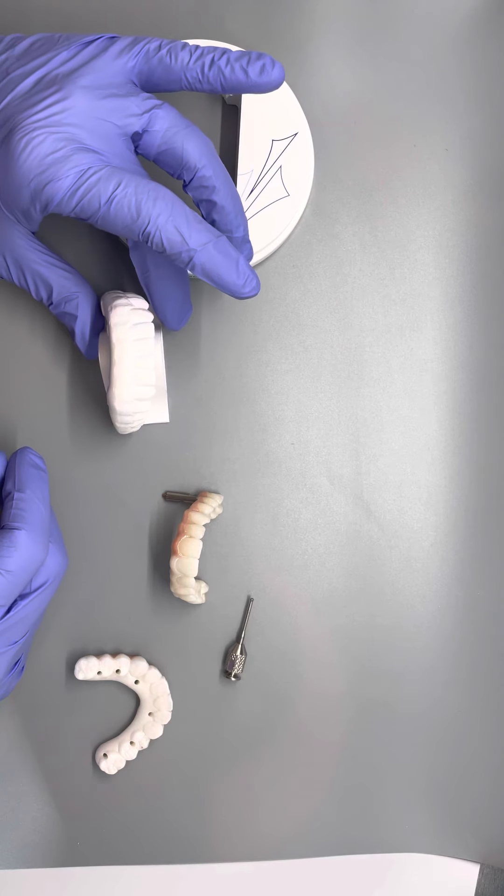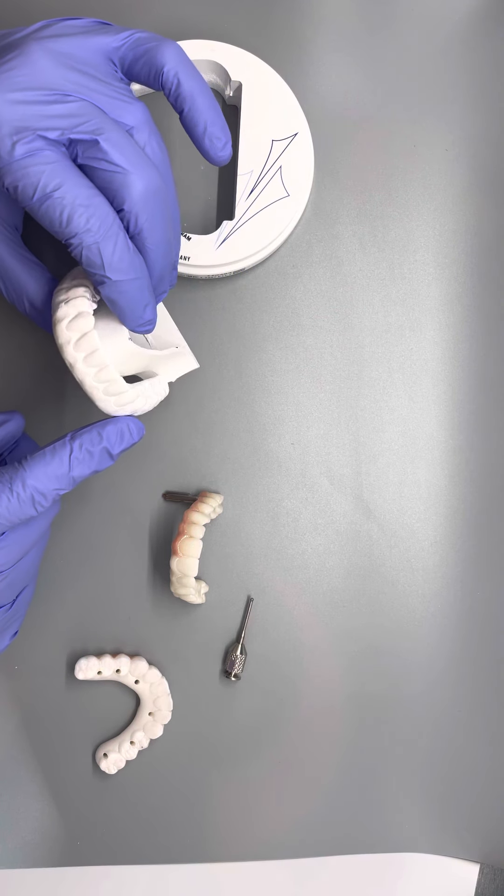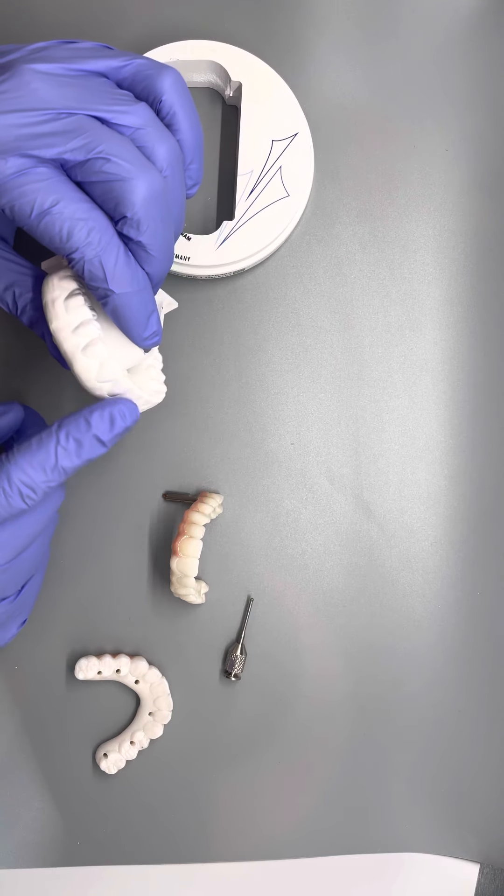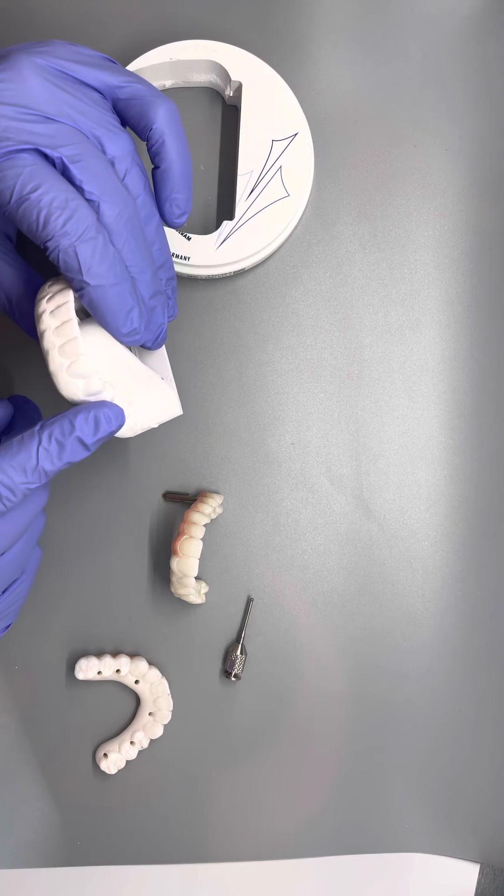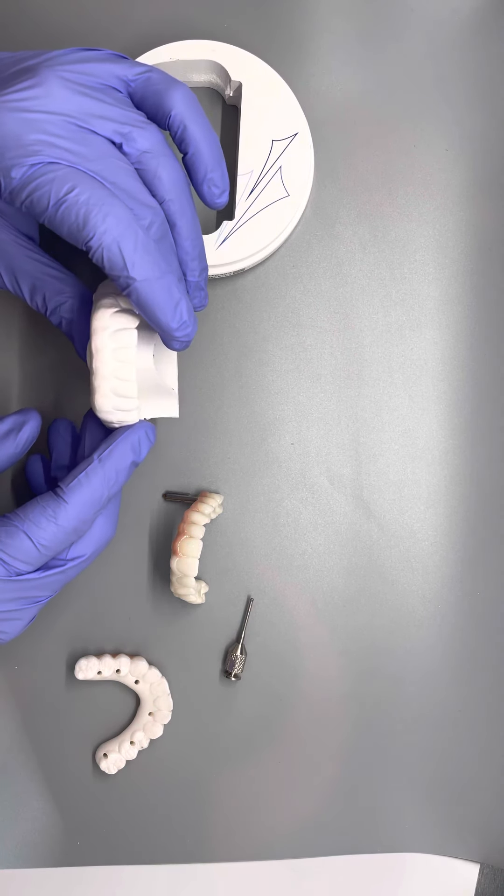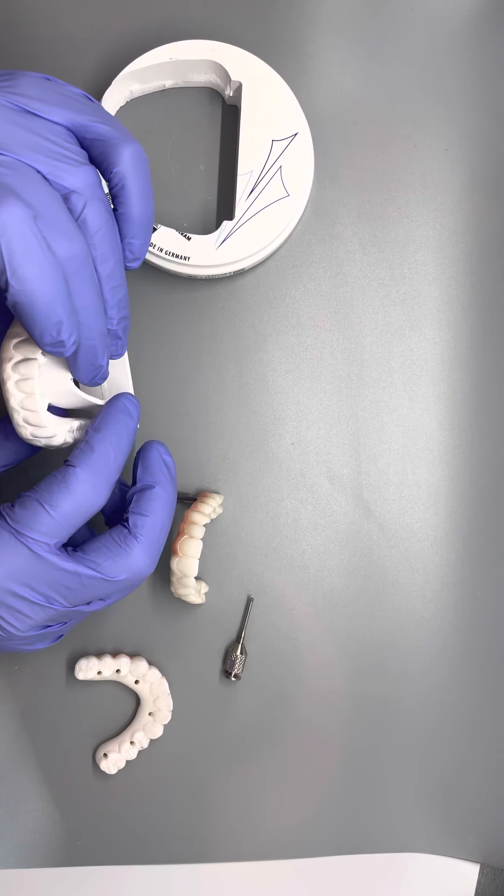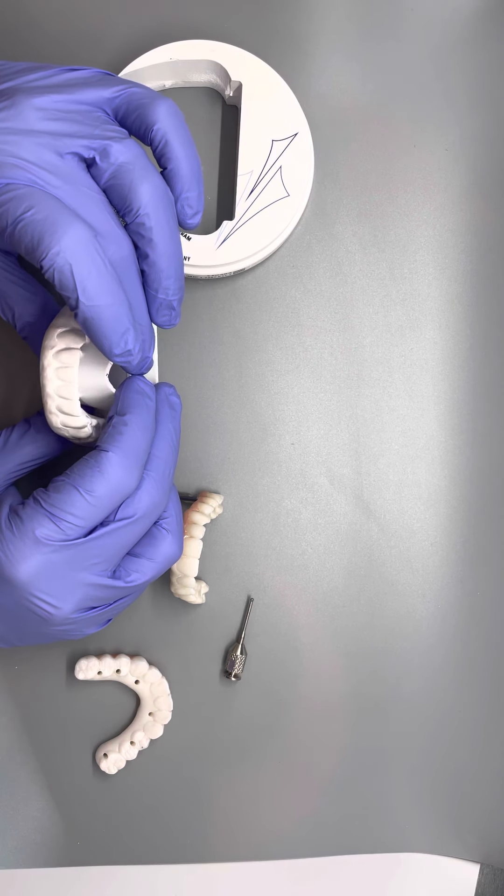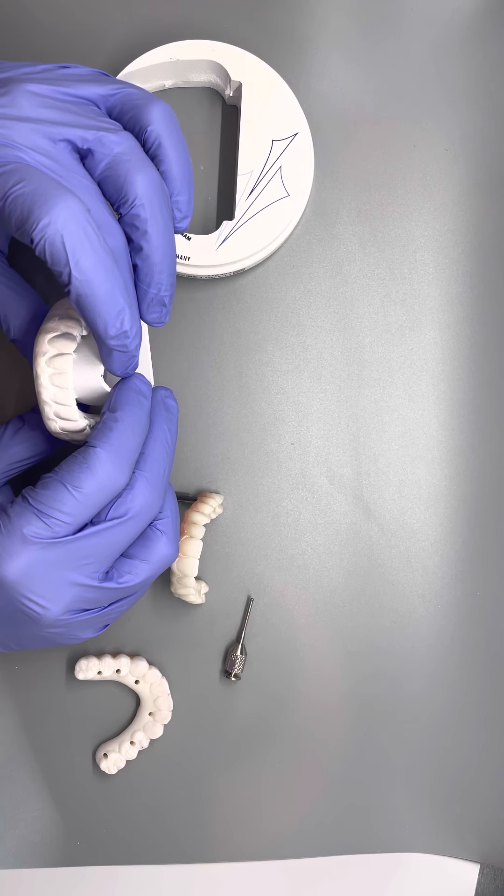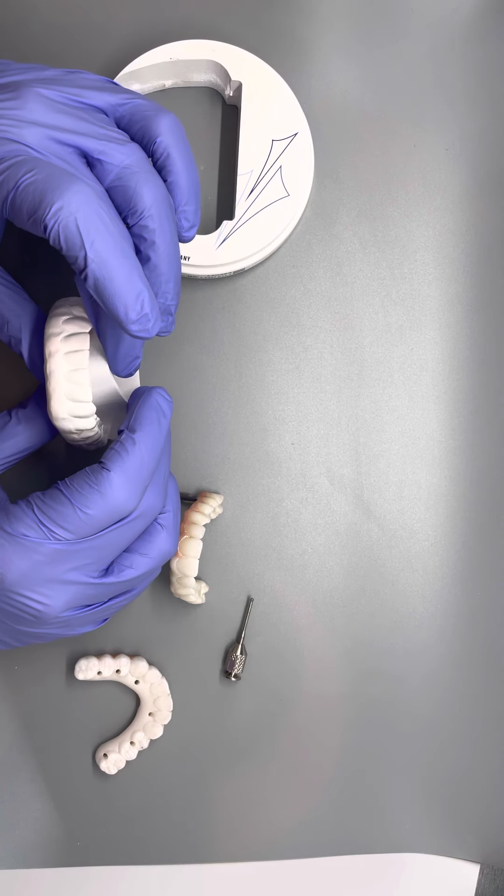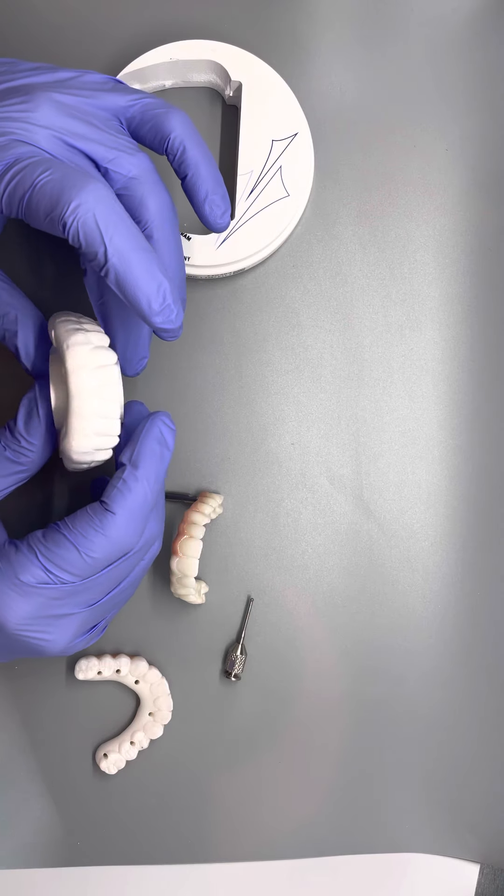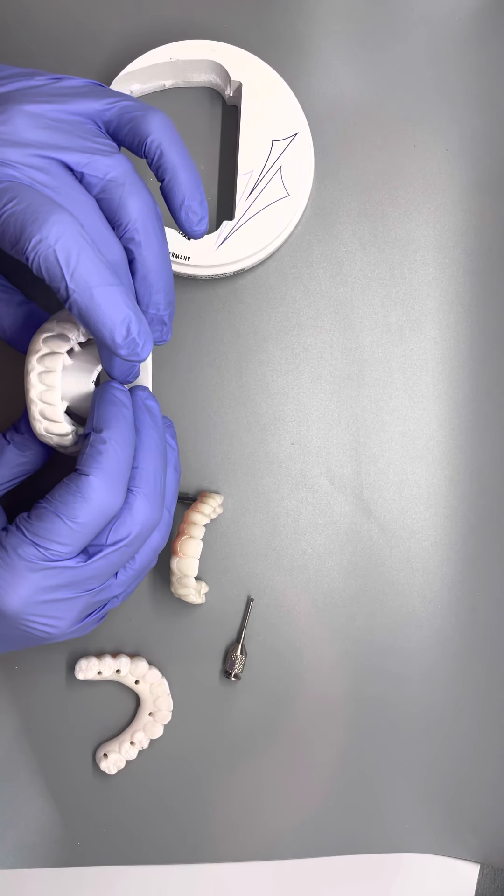So once we get it milled and we make all the customizations to it, give it some character to make it look more natural, then we put it in an oven and we let it cook and it cooks extremely hot. Cooks it about 1500 degrees Celsius and it cooks for a very long time, up to 18 to 20 hours or so.